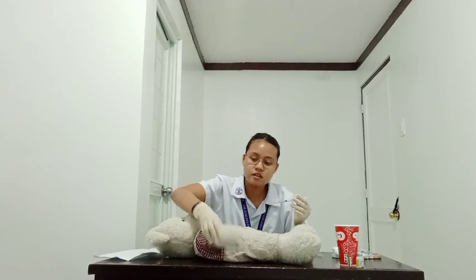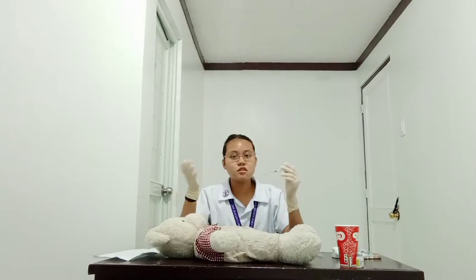So next we need to inject the fluid. With the non-dominant hand, pull the skin at the site until it is taut, because taut skin allows for easier entry of the needle and less discomfort to the patient. Just like this, again, and then we need to insert the tip of the needle far enough to place the bevel through the epidermis into the dermis.